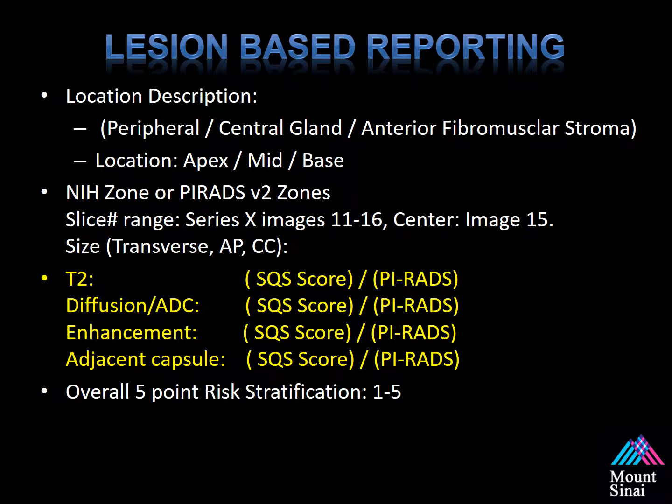It's important to have the series and the images that the lesion is present on. For example, it's located on series X, images 11 to 16, where the center of the lesion is image 15. This will help you target the most optimal portion of the lesion.